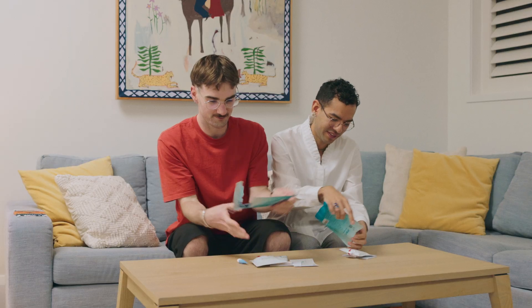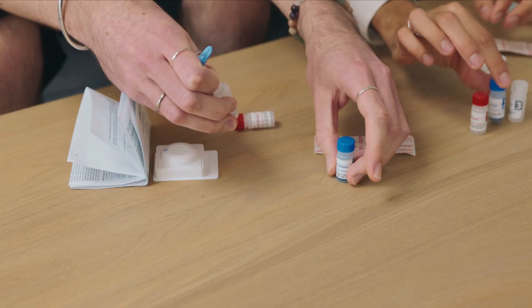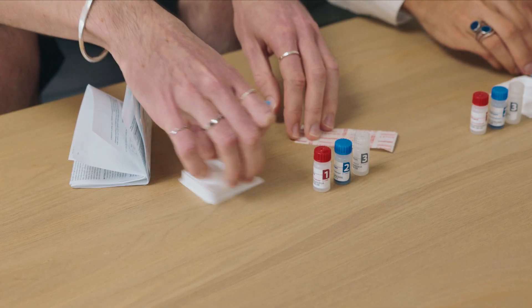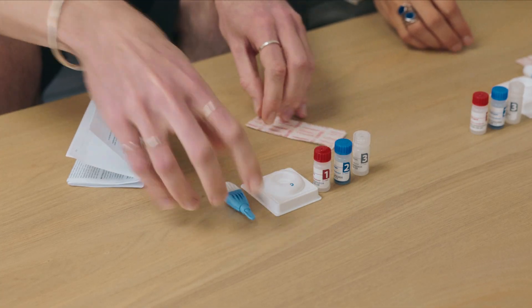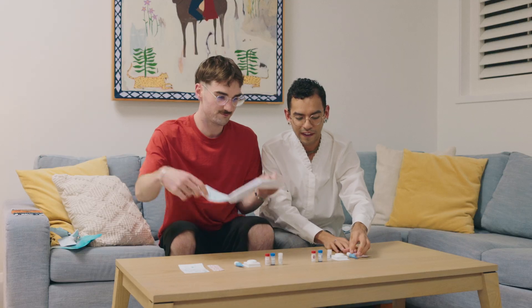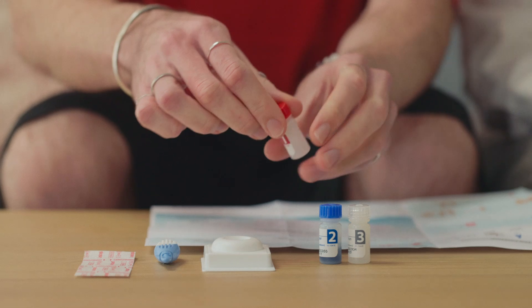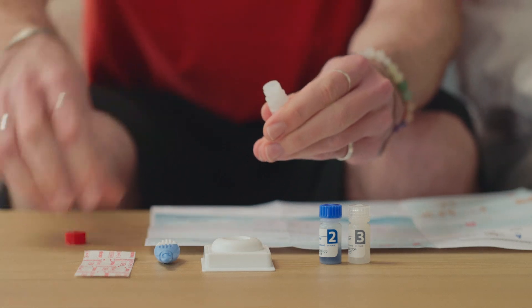Step 2. Lay out your test kit on a clean, flat surface. You will have three numbered bottles, a test device and a finger prick tool. Before starting, make sure you read the instruction booklet. Now open bottle number 1 — this is where your drop of blood goes.